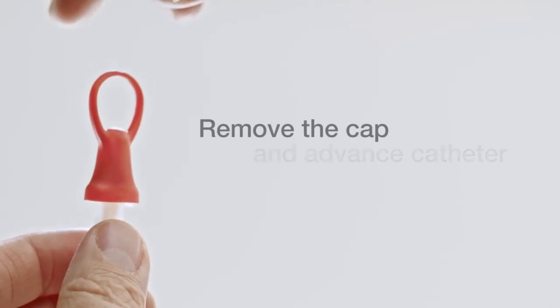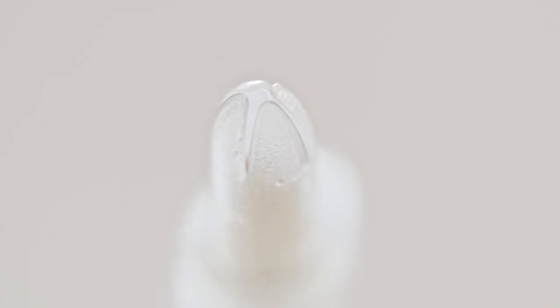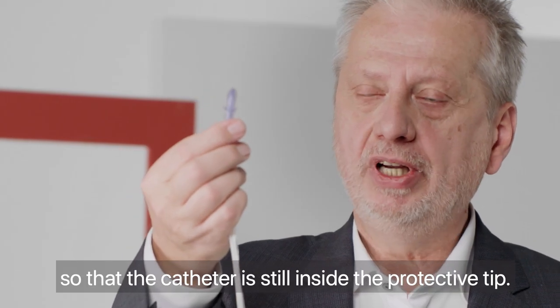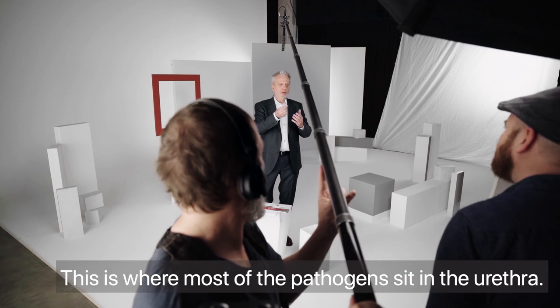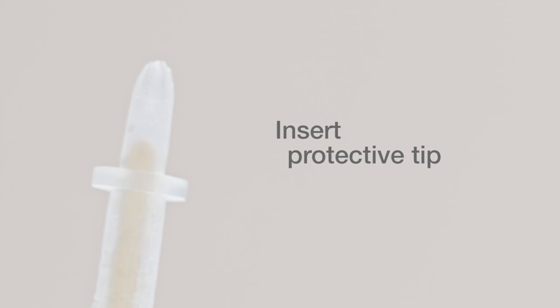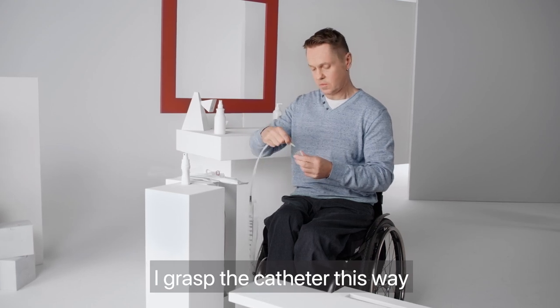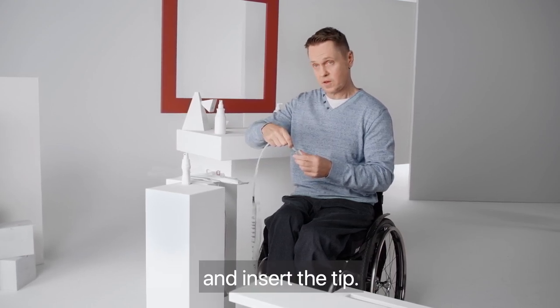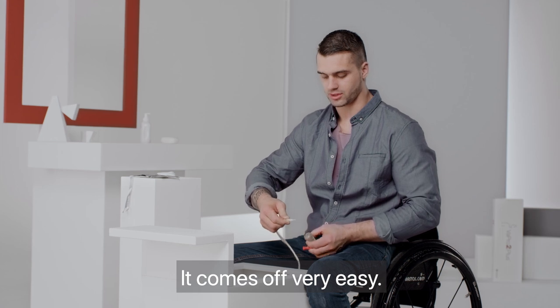To continue, remove the cap. Hold the catheter in one hand and with the other hand advance the catheter forward until the tip of the catheter fills the protective tip, taking care that the catheter does not protrude. Then I take the catheter and bring the slit to the edge, take the tube, remove the cap — it's easy to remove.